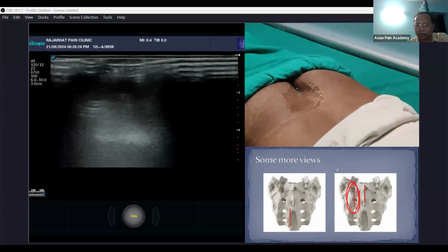You will see all the foramens and the bone in between. Okay. If I go medially, then this will come, and laterally again another small part of bone comes. So this one is called medial sacral crest, and here it can be another part which is lateral sacral crest. So if you can imagine, if I put a short axis view, then how it will be. This is the part of the sacrum, say this is the sacrum. Okay, I put it here. So this is the part of the sacrum.